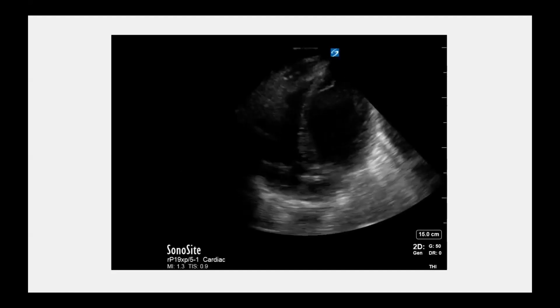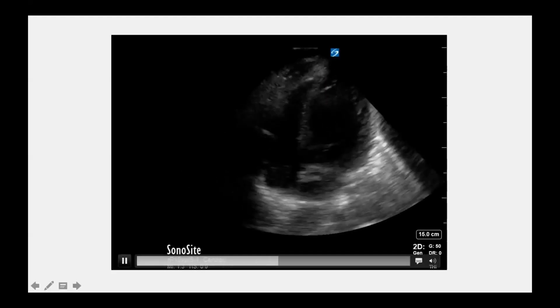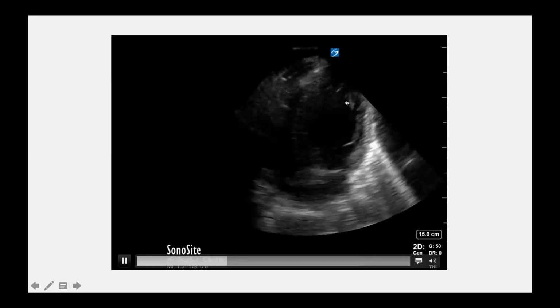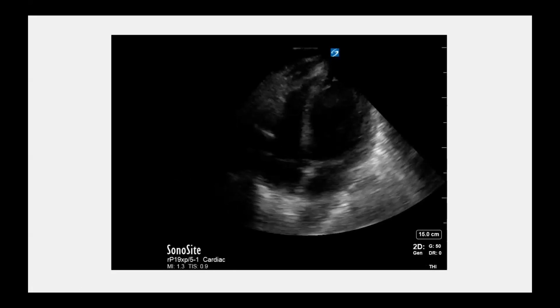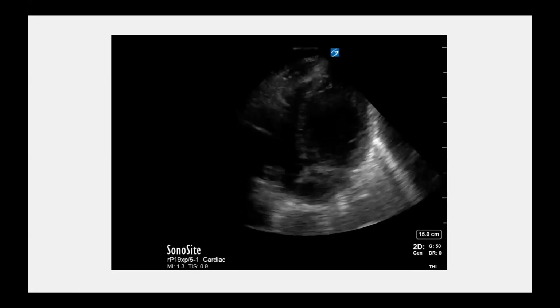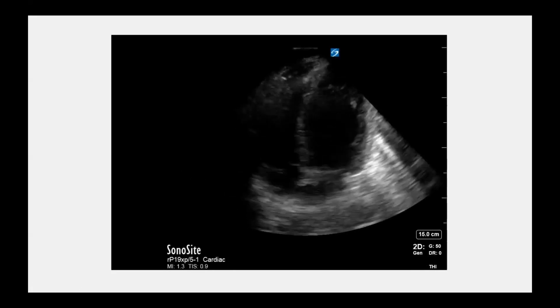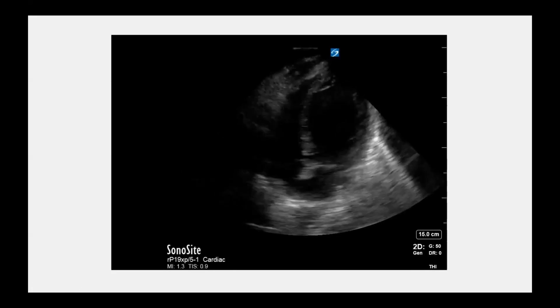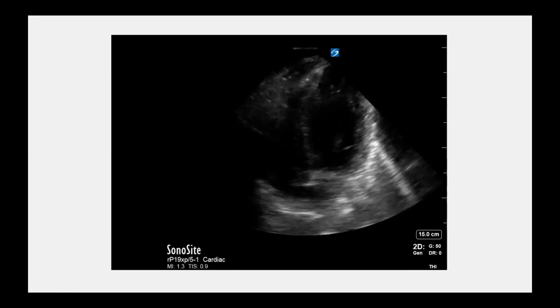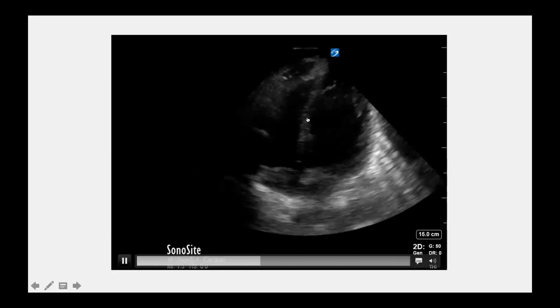It's apical hypokinesis. Yes, so the apical area seems to be slightly depressed. That's why in the parasternal long axis image, just looking at the mitral valve, its overall excursion seemed to be fairly okay, less than what you would expect in that dilated LV involving the mid to apical segments. The mitral valve excursion, the E-point septal separation seemed to be fairly good, but it was only concentrated around the basal segment, which is closer to the valves. And you have the mid cavity, then you have the apical segments.